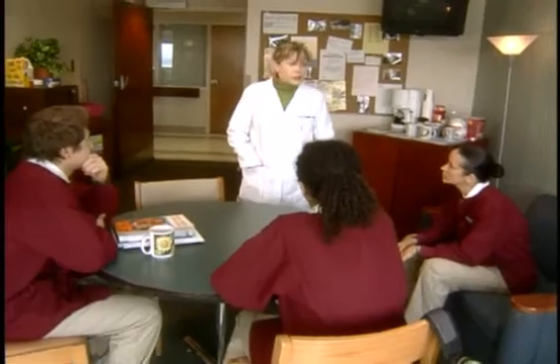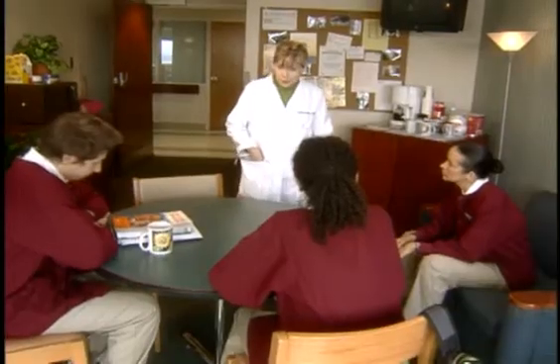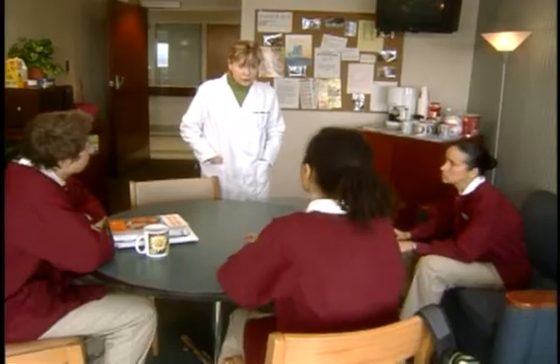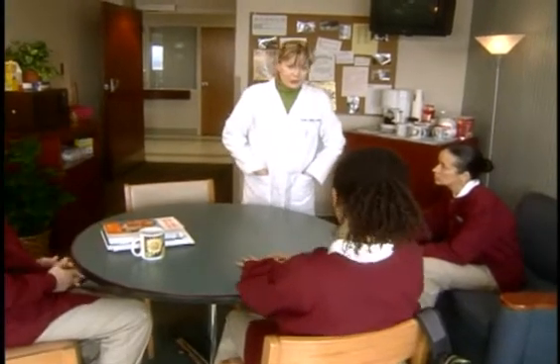The other skills that we want to focus on today relate to delivering supplemental oxygen. Oxygen can be delivered to a patient in a few ways. Each has a specific function and oxygen concentration. The device used is selected based on the patient's condition and their oxygen needs. Now, some of the patients with whom you'll be working today are using either a nasal cannula or a mask. Any questions? No? Okay, well then, Melissa, why don't I follow you to your first patient?